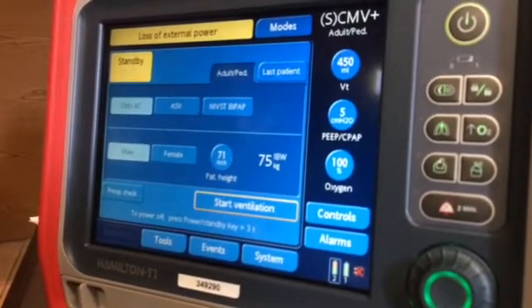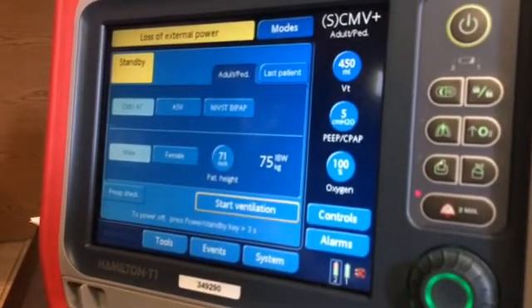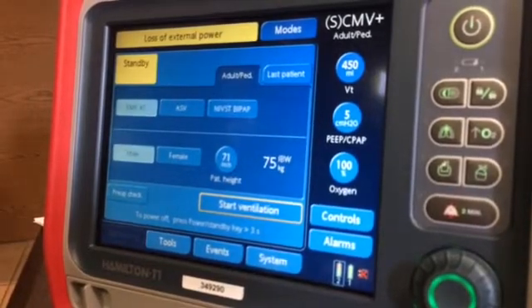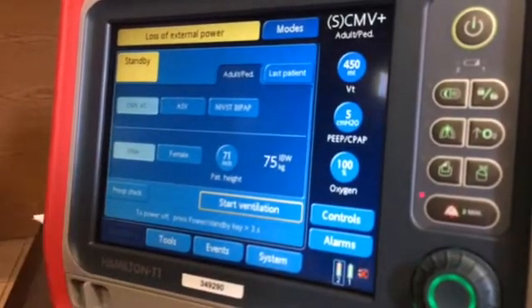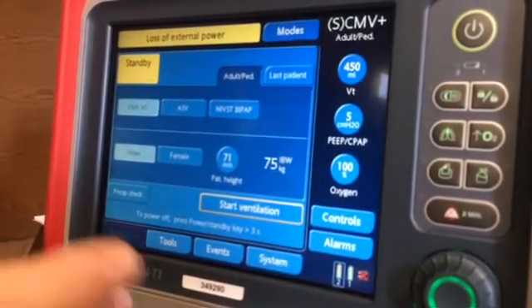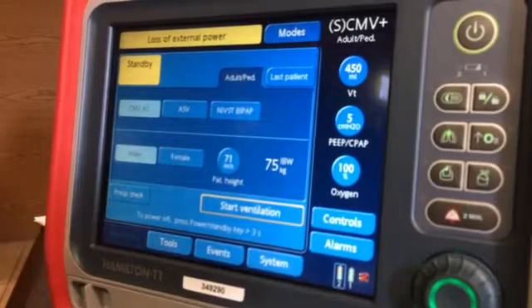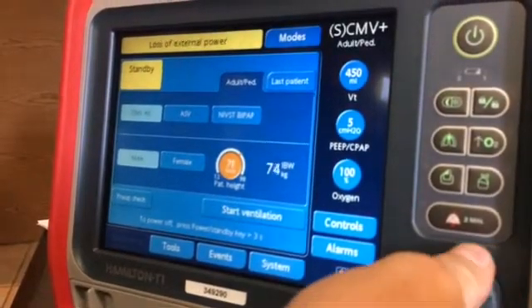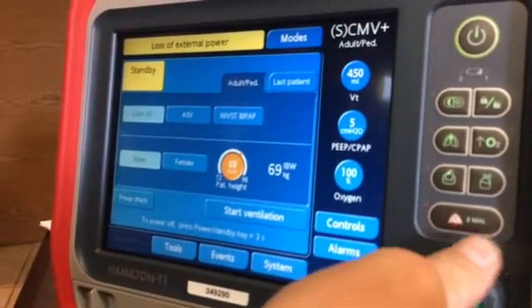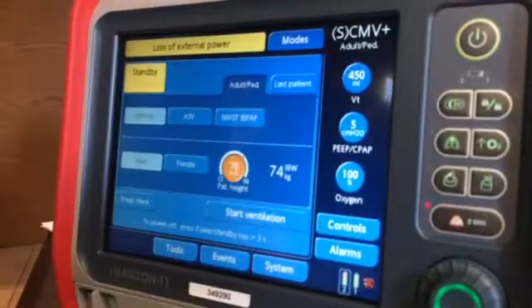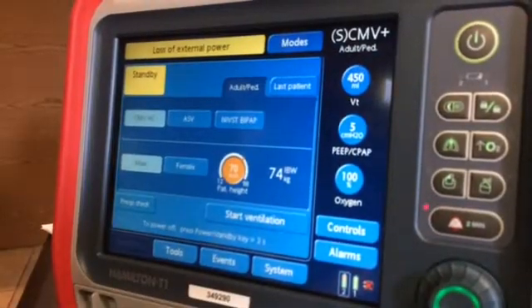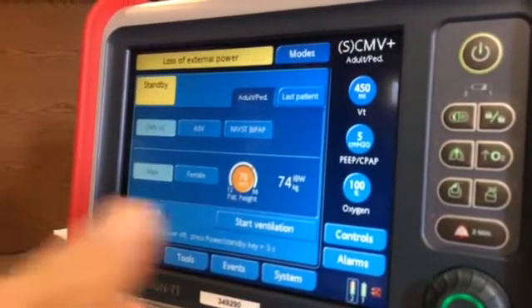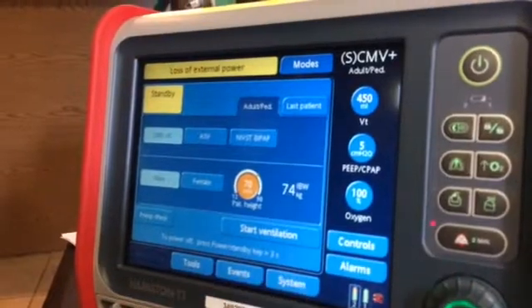We're going to discuss all three modes in detail. One thing I wanted to point out is you do have to choose whether it's a male or female when you're setting up your ventilator, and you do have to put in the patient's height. By doing so, if you notice up here right now, the tidal volume is 450. If I didn't adjust the height, it would stay there.